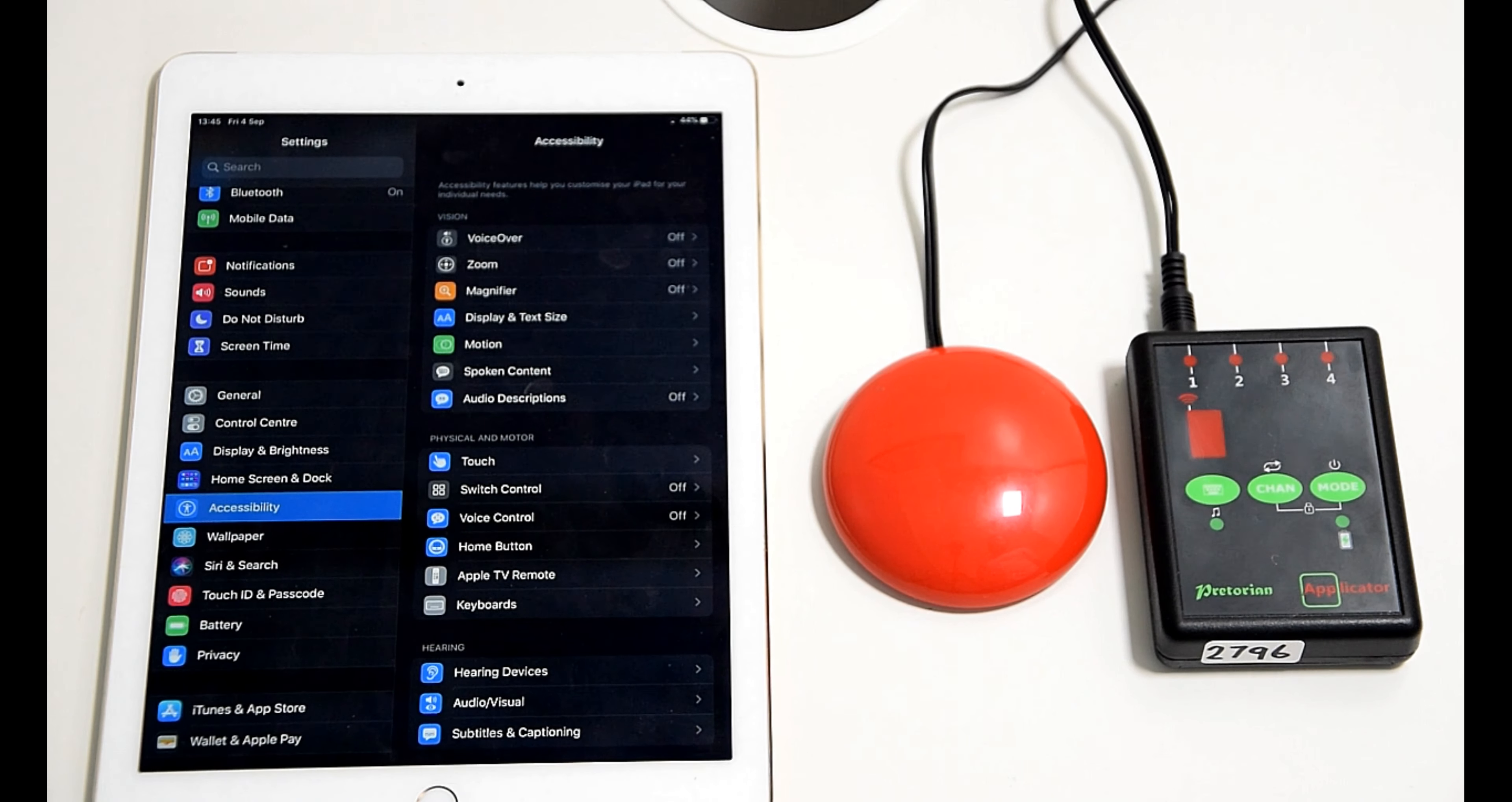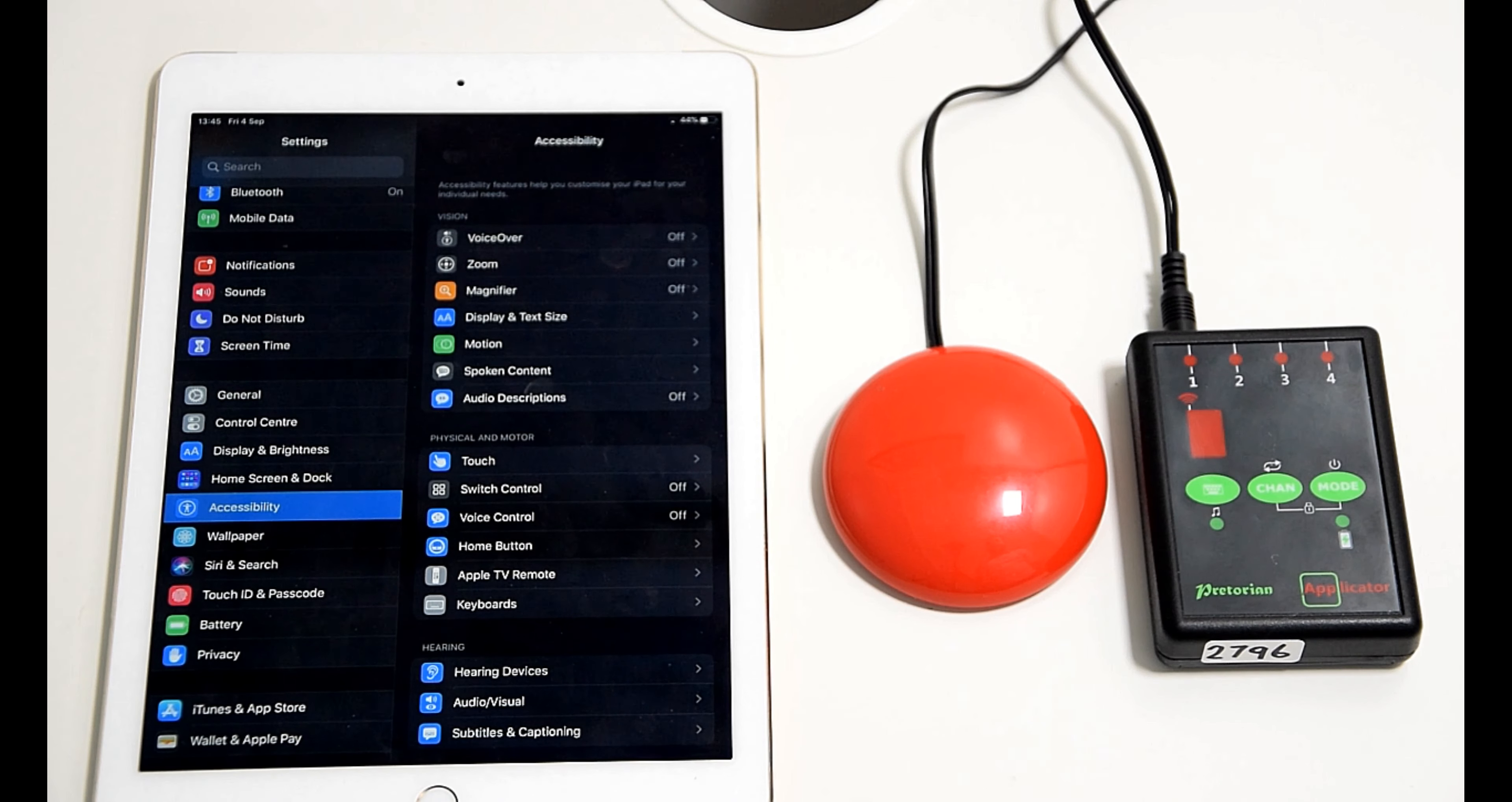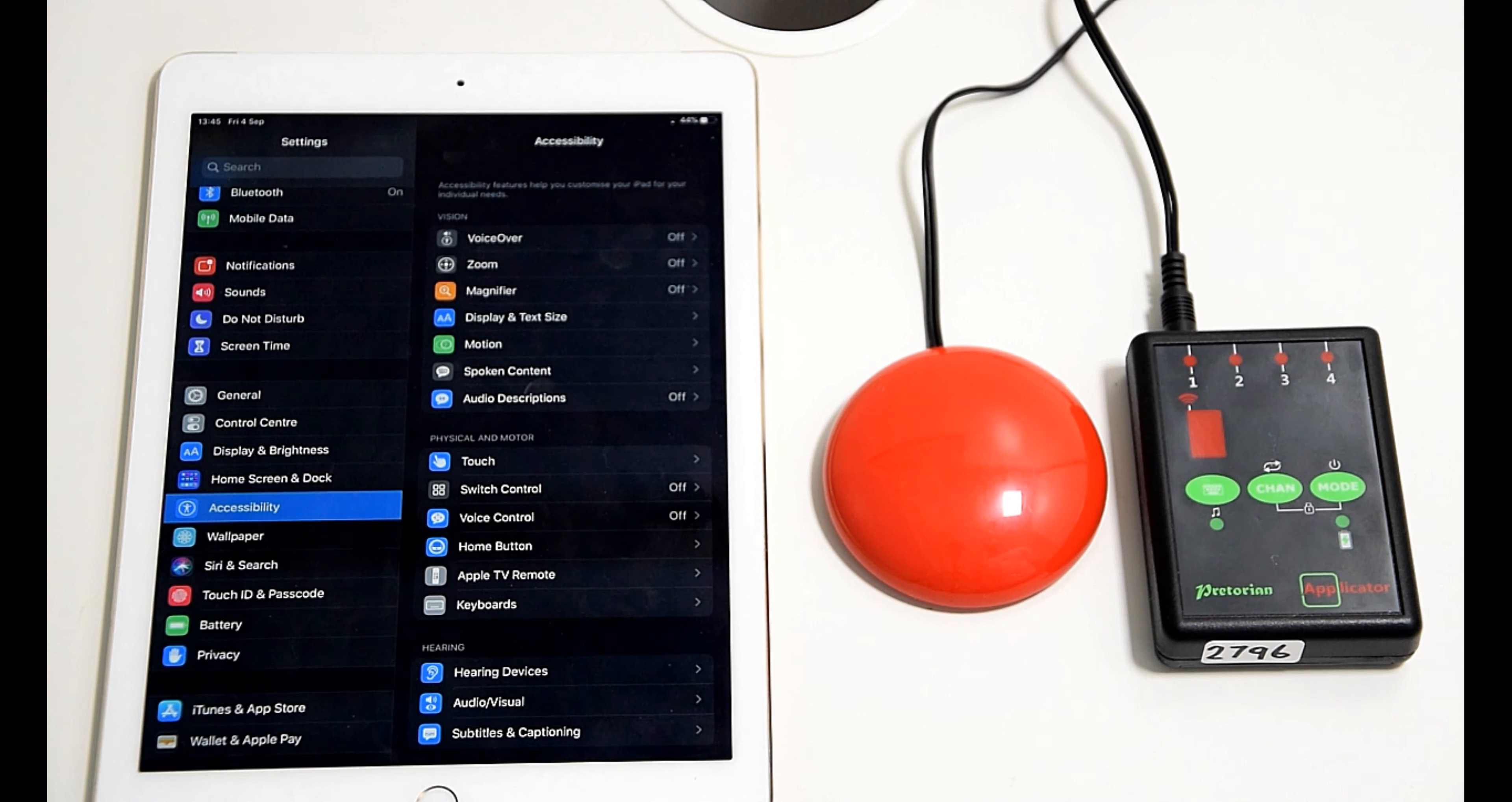For users who only have the ability to use one switch, there's a couple of different methods you can use within the iPad and I'm going to show you them now. There's two options: auto scanning and single step scanning.